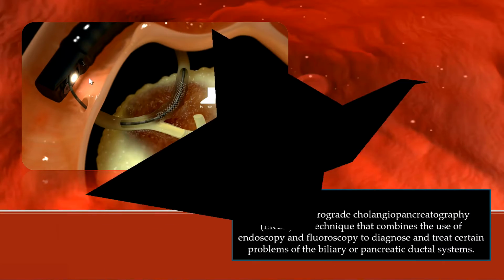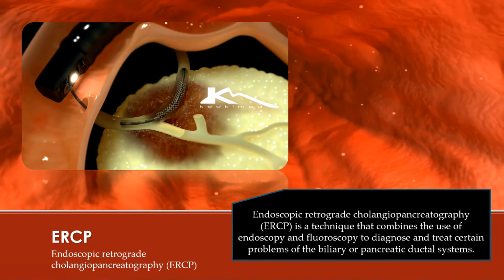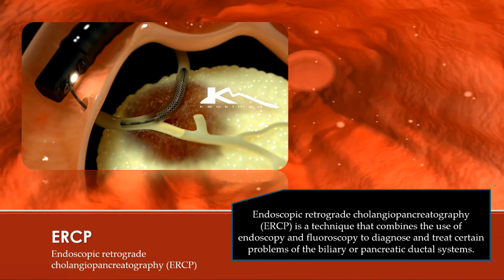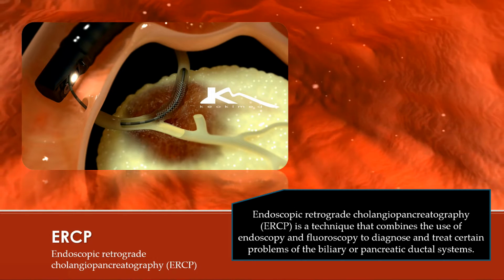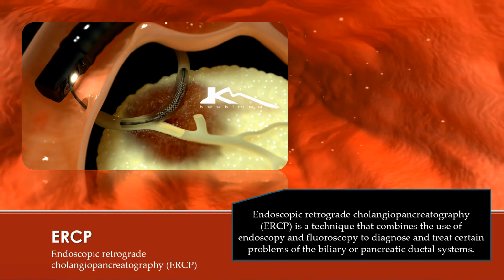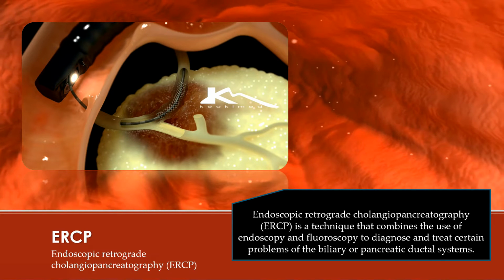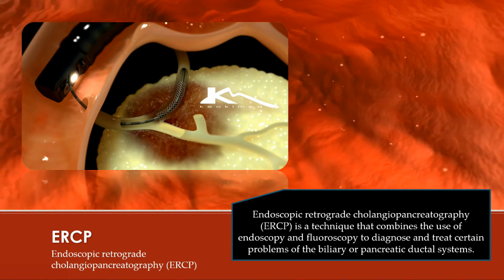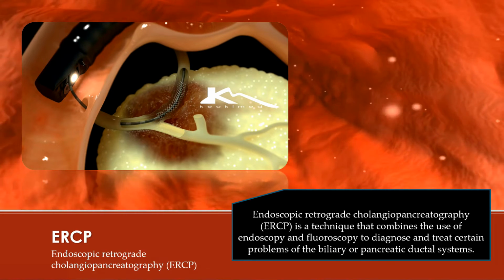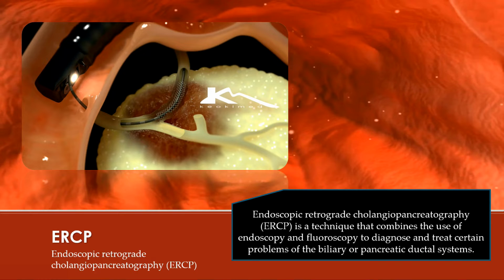So this is the difference in the ERCP. Now when ERCP was invented, it was thought that it is completely minimally invasive and is going to do miracles. It is true, but it is not as innocent as it was thought once upon a time. It is very strange that if you do a literature review of the complication rate of ERCP versus laparoscopic CBD exploration, ERCP has a higher complication rate than laparoscopic CBD exploration. ERCP mortality is also up to 0.5%. But still ERCP is the gold standard.